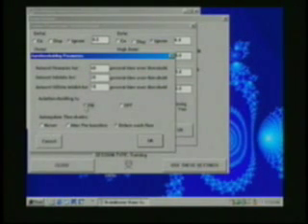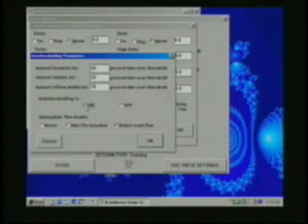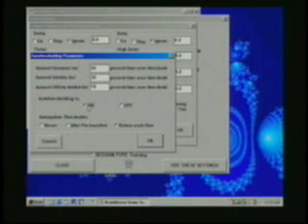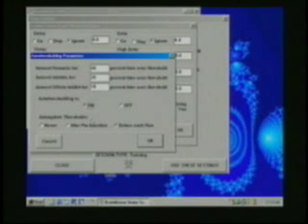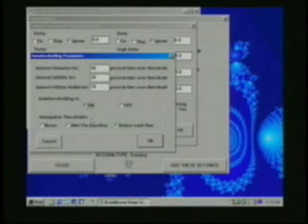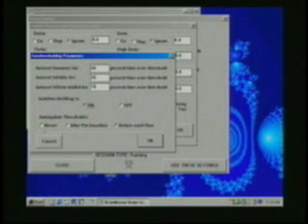When auto thresholding is turned on, there's a choice of when these thresholds will be updated. Auto thresholding basically means the computer finds new thresholds. Auto updating has to do with when those thresholds are automatically used for the next threshold. Auto update is an automatic function.